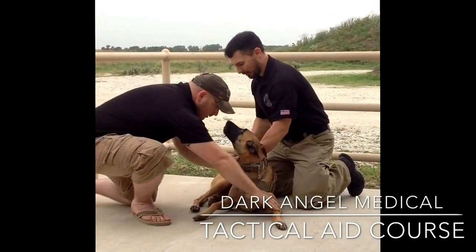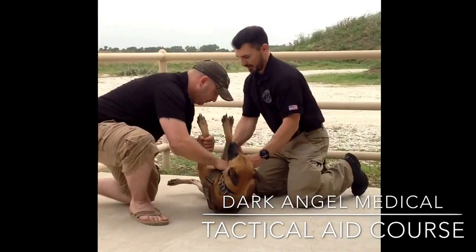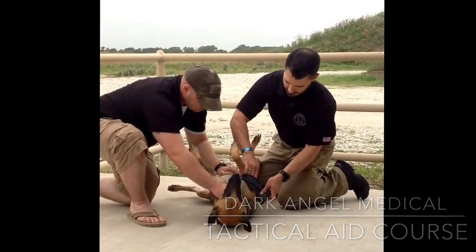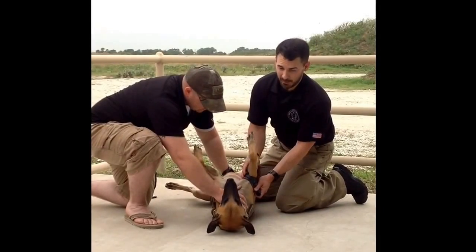What we're going to do is get her to roll over — don't bite me, scouts. We're going to get the tourniquet up, and we do it just like on a human being: we're going to go high and tight. We can roll this until we've got all the bleeding stopped and keep it in place.